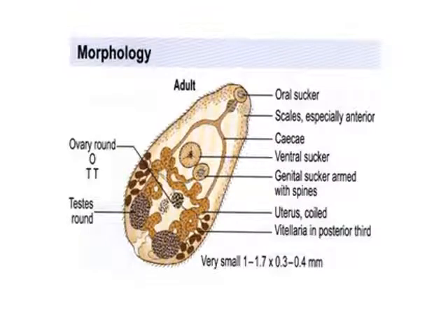Now here are the morphological features of the adult worm. The photo here can show you the outer spines; the tegument of this worm is equipped with spine cover — spines are very clearly visible. There are the ventral sucker and genital sucker, both armed with spines. Now the uterus, and the vitellaria in the posterior third — the viteline gland is visible posteriorly.